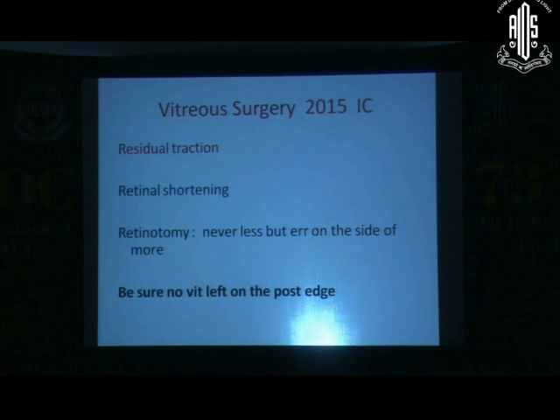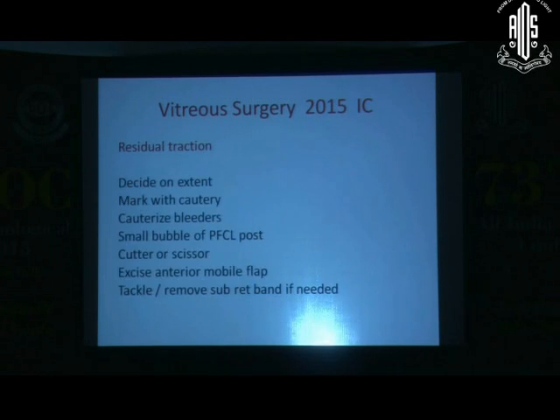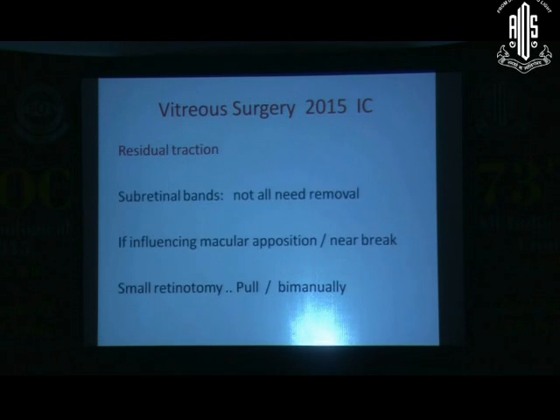Good hemostasis should be achieved before we do this, and there should be no traction or vitreous left on the posterior edge of the retinotomy. We go with these steps of retinotomy. I can't discuss these in detail today.